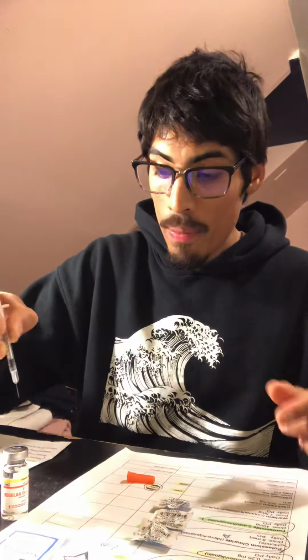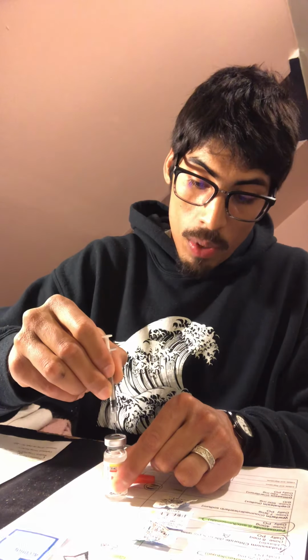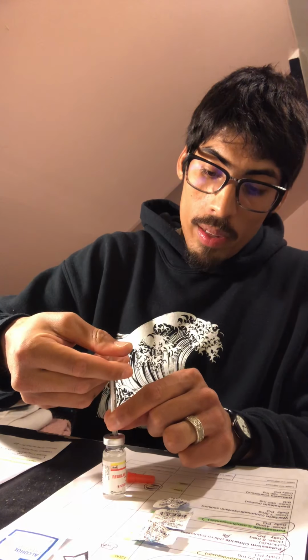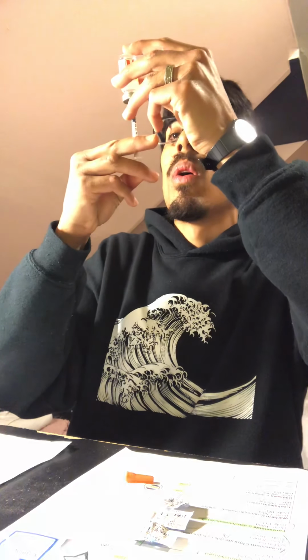Now that it's dry, you can nice and easy put it right in the middle. Put the air in, flip it upside down, make sure that it's in the liquid, then you're going to draw. Nice and easy. I'm going to draw your 4 units.